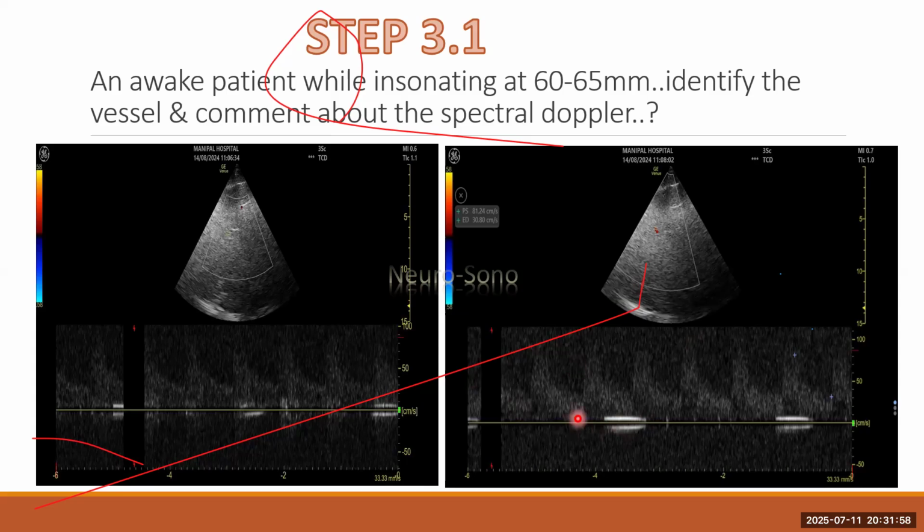Here we can see the upstroke, right? This could probably be microthrombi. Are you able to see my red pointer? Yes, sir. This could be microthrombi. What is this? See, this is not turbulence because turbulence would be highest in the systolic part. Here we can see this is a waveform which is rising. In the systole, it is free of such aberration. What could it be?